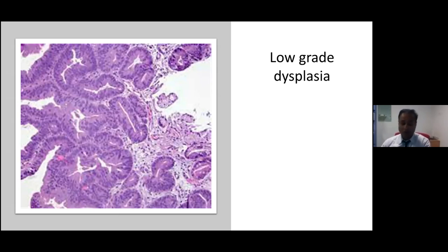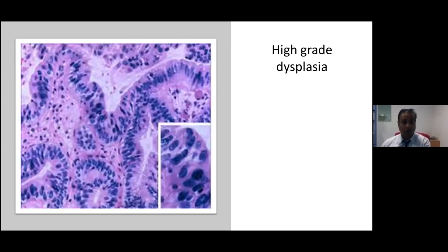In high-grade dysplasia, the polarity is lost and there is marked nuclear hyperchromasia, nuclear crowding, and cribriform architecture with some intraluminal papillary formation. This would be classified as high-grade dysplasia.